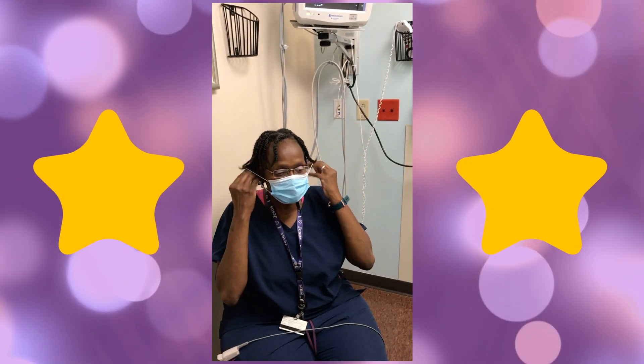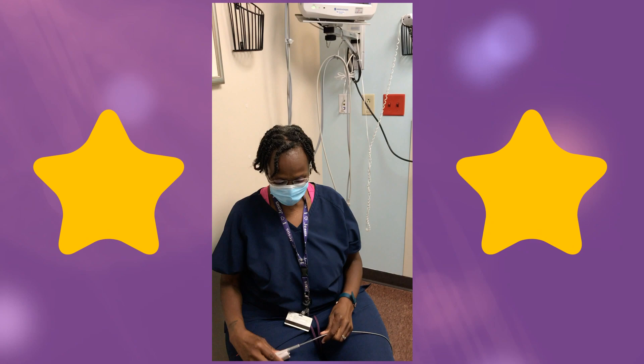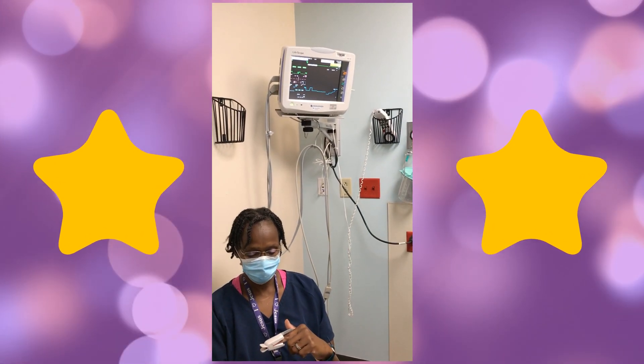She's going to put her mask on and then proceed to put the pulse ox on the same finger, and let's see what result we get.